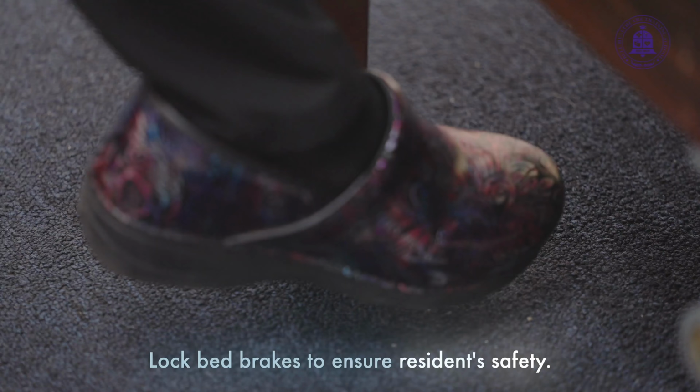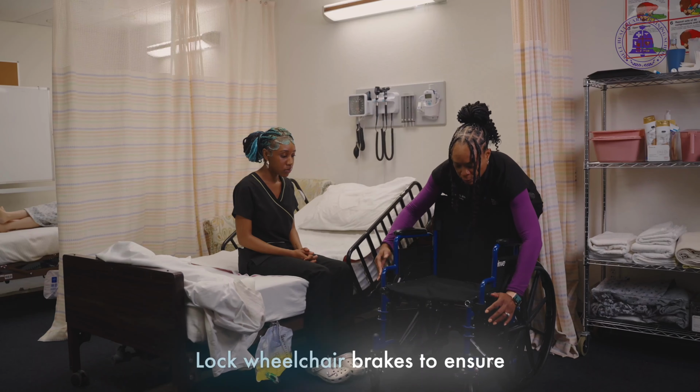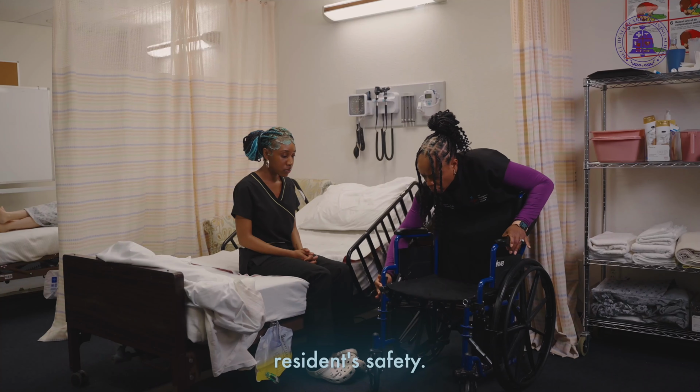Assist resident to put on non-skid shoes or footwear. Adjust the bed height to ensure that the resident's feet are flat on the floor when sitting. Lock bed brakes to ensure resident's safety. Lock wheelchair brakes to ensure resident's safety.